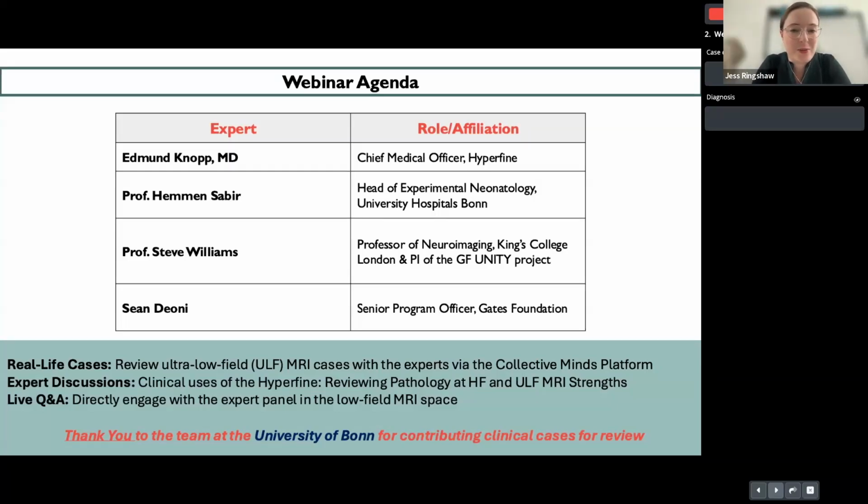We have an exciting new platform to introduce today for this webinar, which has been developed by Collective Minds and is a new seminar feature that should hopefully make this more interactive and easier to follow for the attendees. To summarize how it will work, there will be 5 cases that have been kindly contributed by the team at Bonn University. A huge thank you to all of them who've sent through information and scans for us to review. We're going to go through those one by one, and as we go, there will be interactive sections where people can respond to a poll, anonymously.